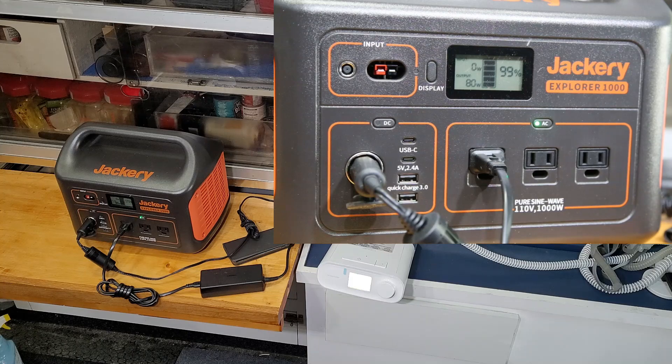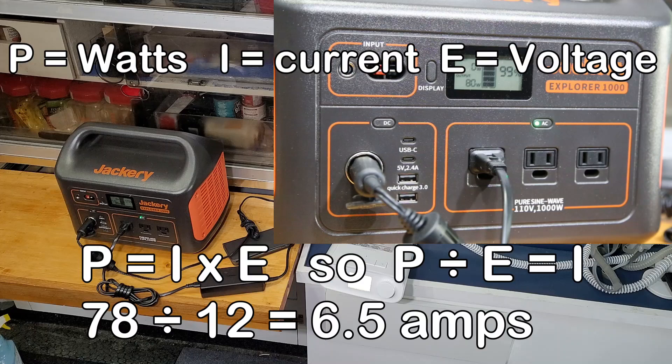I'm going to do an on-screen display of the actual current draw. Power equals current times voltage, so we're going to figure it around: power is 78 watts divided by 12 volts equals 6.5 amps current draw.